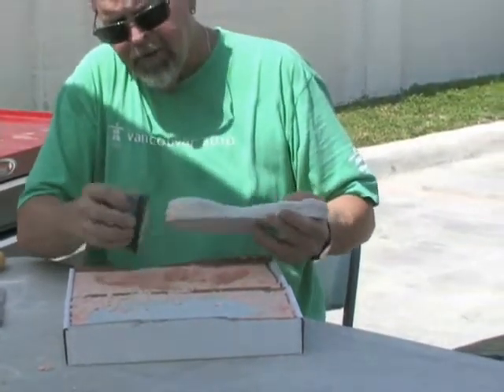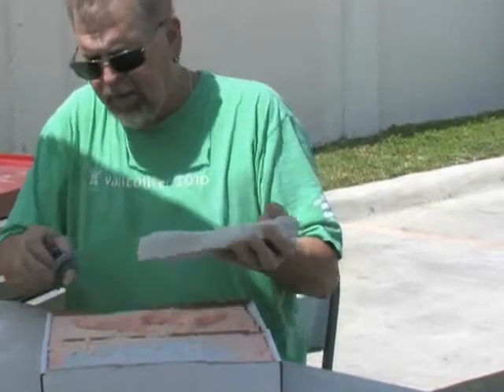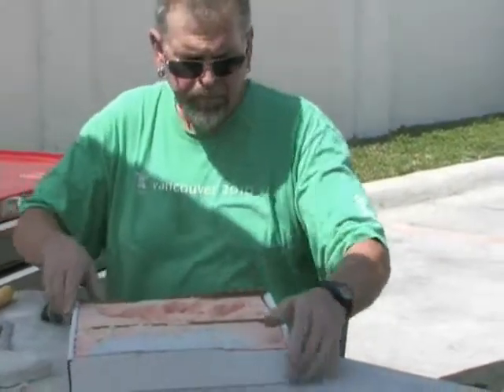I'm getting all of the foam off of here, or as much as I can. Now I'm going to put this so that it'll blow right into you.